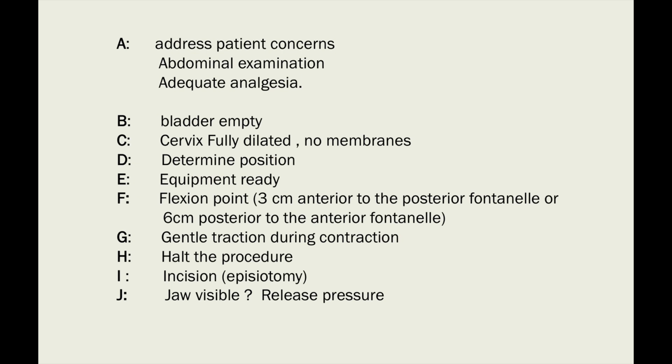and what are the complications from this procedure? Again, we divide them into maternal and fetal. The maternal complication is mainly perineal tears, and these tears can even extend to become third or fourth degree tears. For the fetal complications, we need to tell the patient from the beginning that she may expect some swelling in the baby's head, called chignon, which will go within 24 to 48 hours and doesn't have any effect on the baby.